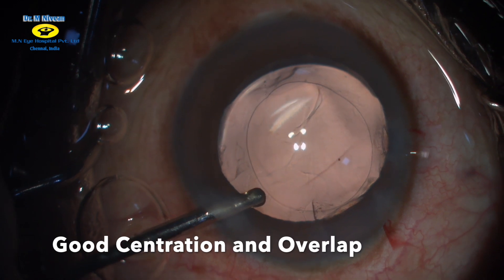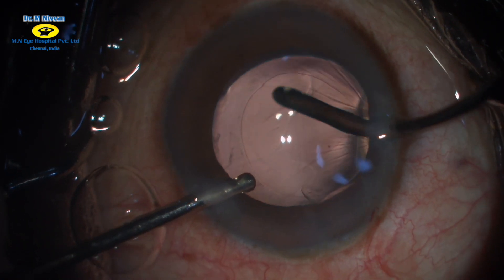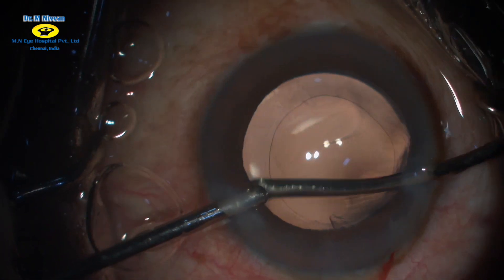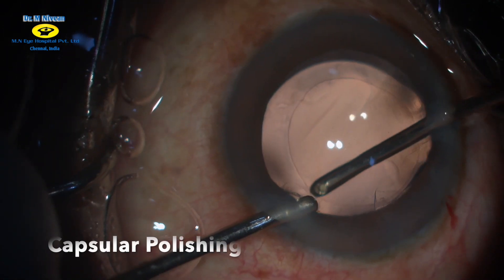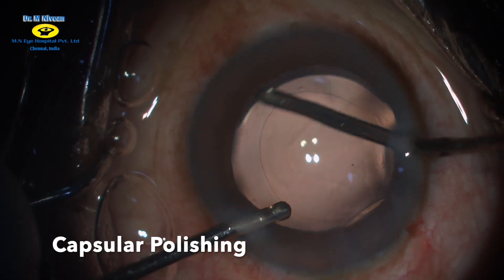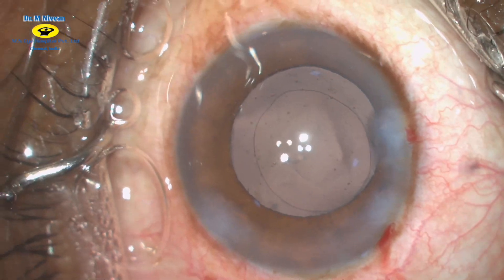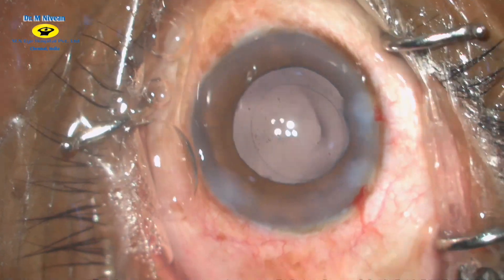The good centration of the IOL and the 360-degree overlap of the anterior capsular margin can be appreciated. Mild anterior capsular polishing is done and the wounds are hydrated. That marks the end of the surgery. Thank you.